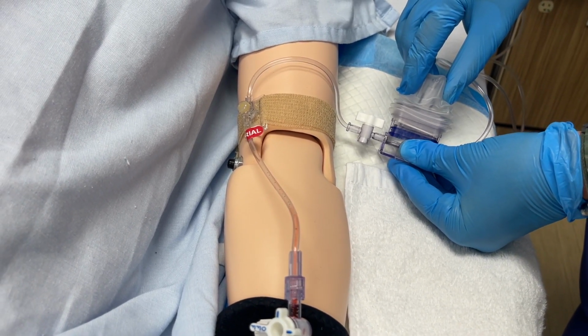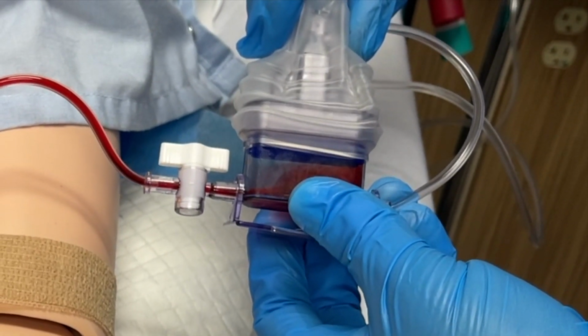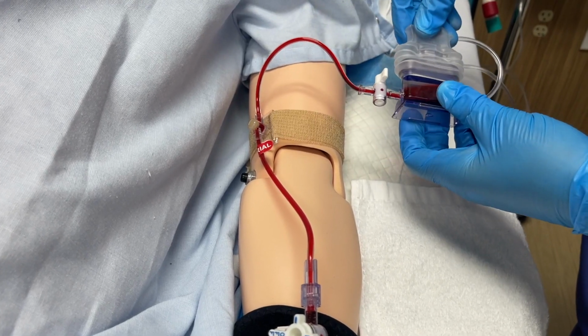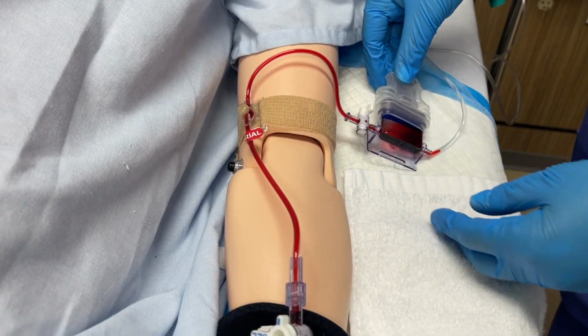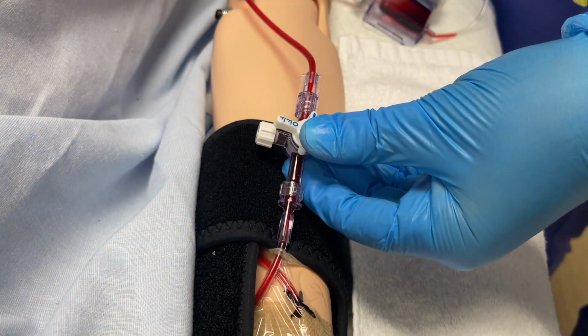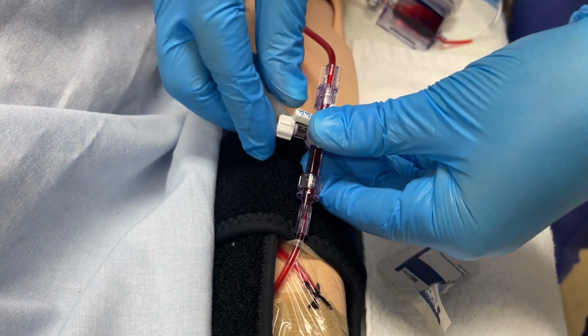You will pull this back until the reservoir will no longer pull back any further. You will then turn the white lever to turn the lumen off to the safety fluid reservoir, keeping the waste above the level of specimen collection. Just like with the first arterial line, we will utilize the stopcock's extra port to access our blood specimen.